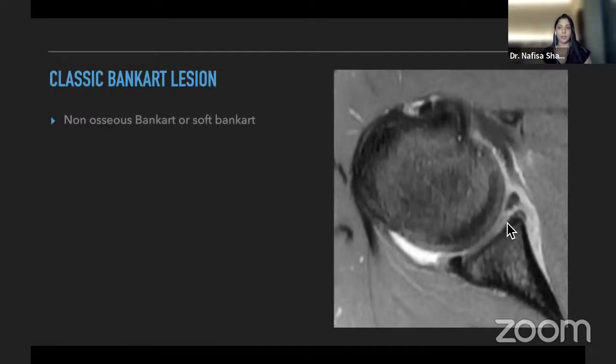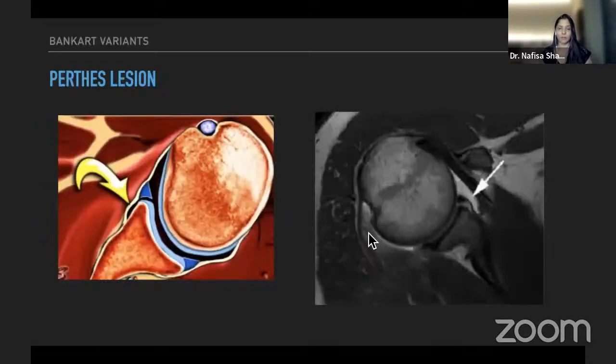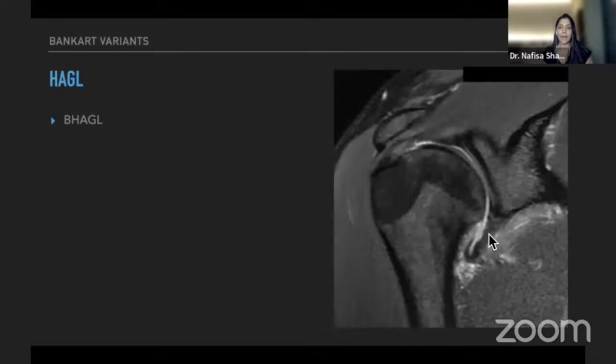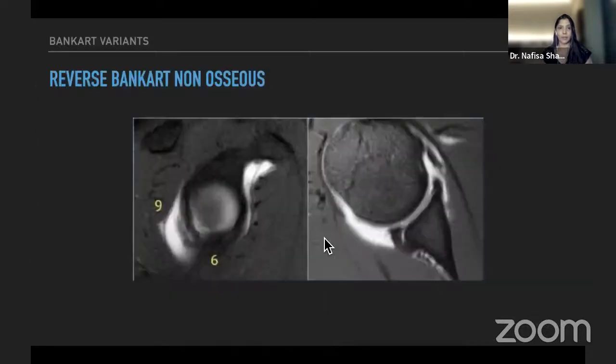You can see a classic Bankart lesion where there's a complete full thickness labral tear, and there's a periosteal tear as well, and there's edema in this region. You can have an osseous Bankart lesion, which is just a chip fracture of the anterior inferior glenoid. A Perthes lesion where the periosteum is intact, but there is complete labroosseous and labrochondral separation, and there's a pouch formation. These lesions are sometimes occult and best seen if you do an ABER view, which is abduction and external rotation. ALPSA is when the labrum gets macerated and medialized. And a HAGL lesion, which is important, is the humeral avulsion of the IGHL. Here's a HAGL that is actually displaced, and it's between the axillary artery and nerve.